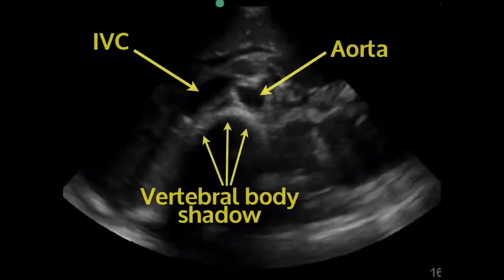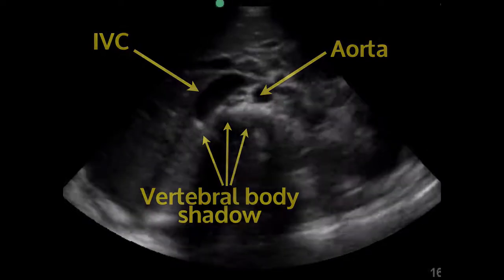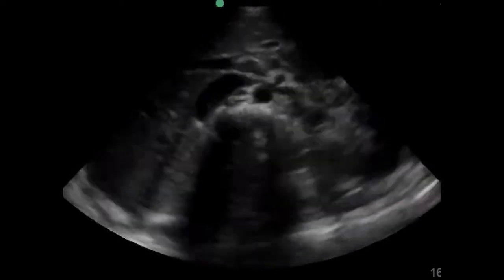Here's a still image of the aorta. We have the aorta on the right side, the IVC on the left, and the vertebral body shadowed underneath. You'll see as I roll through this, you want to follow it all the way down until it splits into the iliacs — you want to evaluate as much of the aorta as you can.